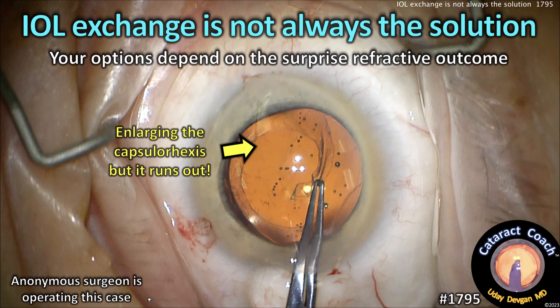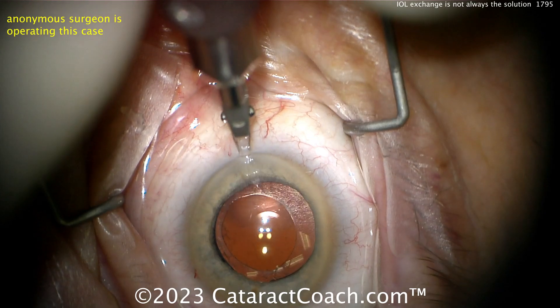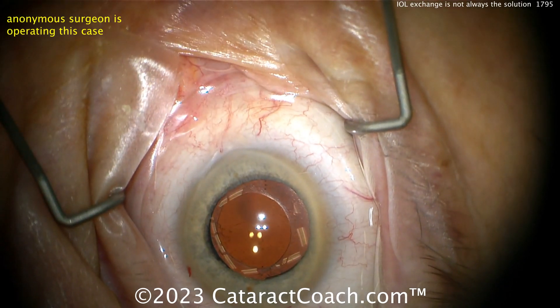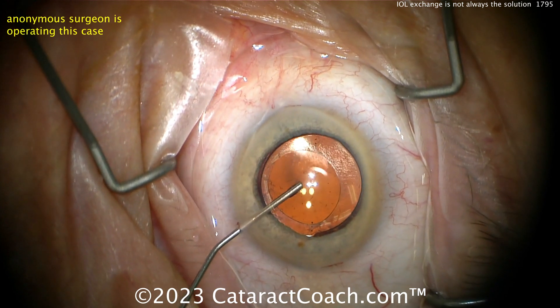cataractcoach.com — IOL exchange is not always the solution because your options depend on the surprise refractive outcome. Let's watch this case. Anonymous surgeon operating; the patient had what looks like an extended depth of focus toric lens.